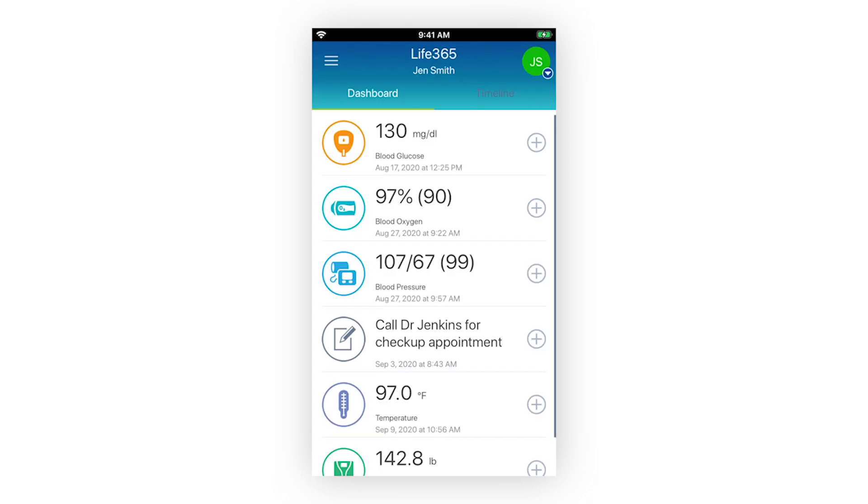Upon sign-in, you will be navigated to your Life365 dashboard. Your dashboard will provide at-a-glance information for all your preferred measurement types and most recent measurement readings.